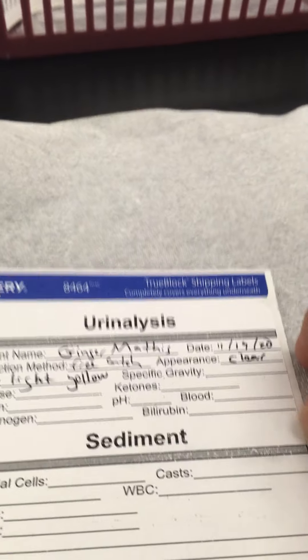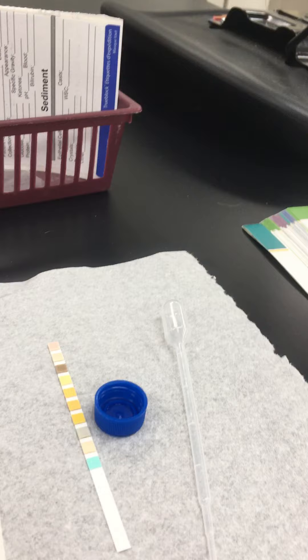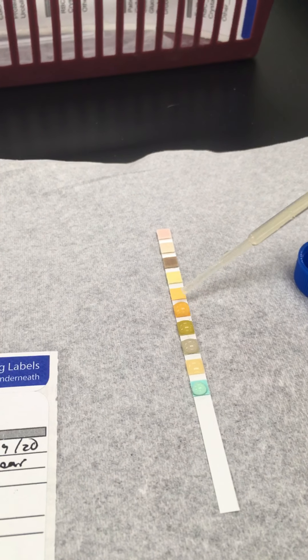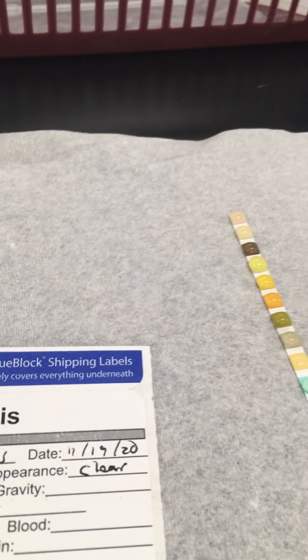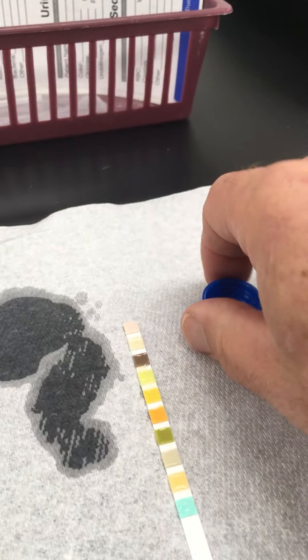Now let's do the actual reagent dipstick. There are a lot of different ways you can do it. I'm going to take the cap off, get my pipette, and grab some of the urine. I have it in my pipette and I'm just going to saturate the strips — just get those nice and wet. I'm going to do this fairly quickly, mix it on there a little bit, and once it's saturated, just tap off all the excess. Then I'm going to look at the clock and wait about 30 seconds before I start reading.